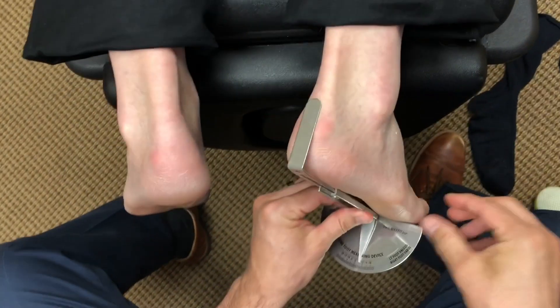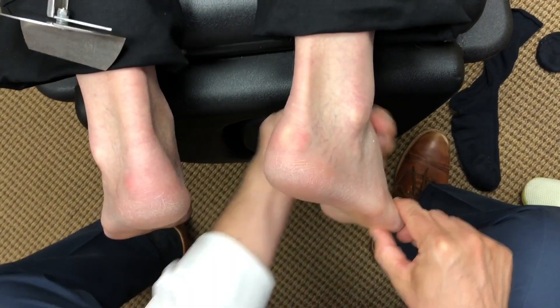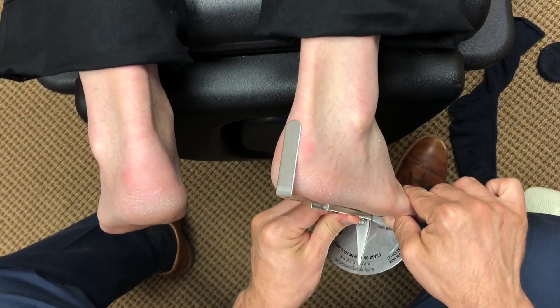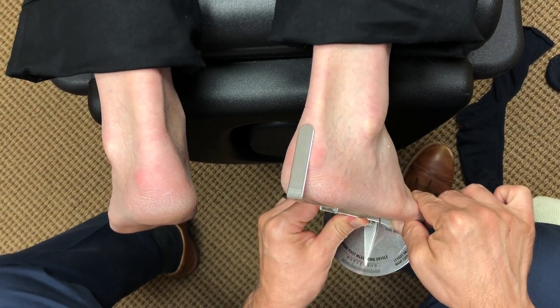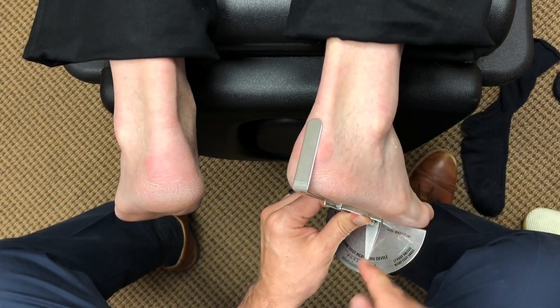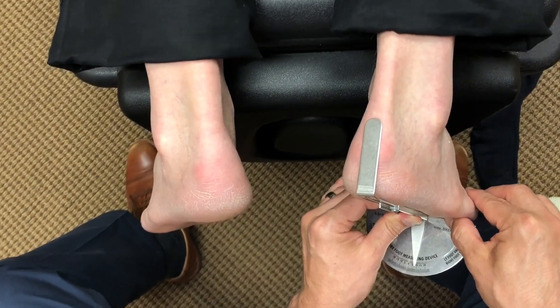Same thing: find the fifth met head, find subtalar neutral, lock the forefoot on the rear foot. Then we have the vertical upright lined up with the Achilles. Now we take a measurement — we can see that it's about a seven.